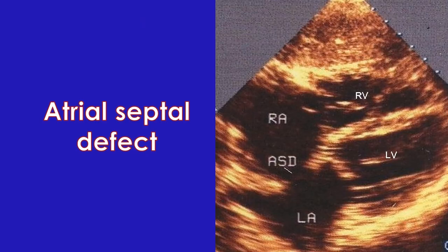Defects in interventricular and intraatrial septa will be mentioned if present, along with the location, size and shunt across it. If there is no defect, it is reported as intact intraatrial and interventricular septa. Presence of a patent ductus arteriosus will also be mentioned similarly.